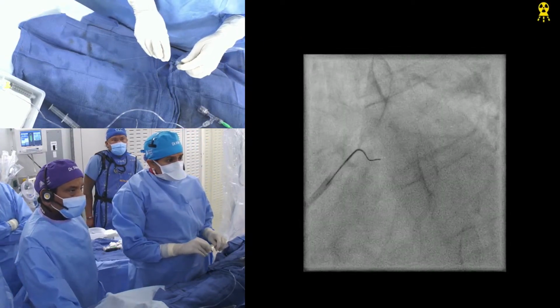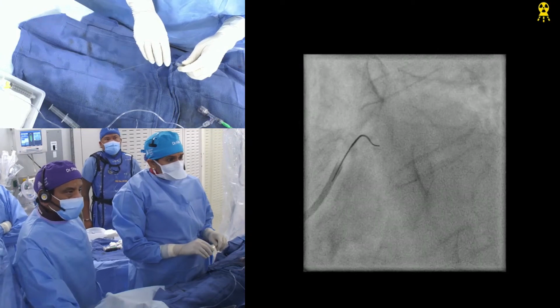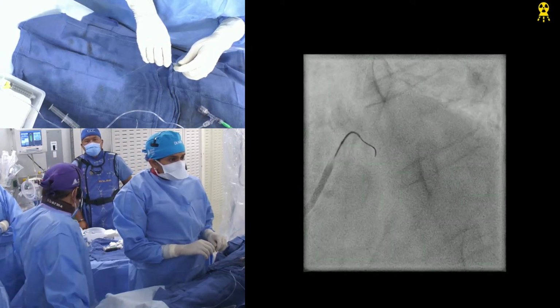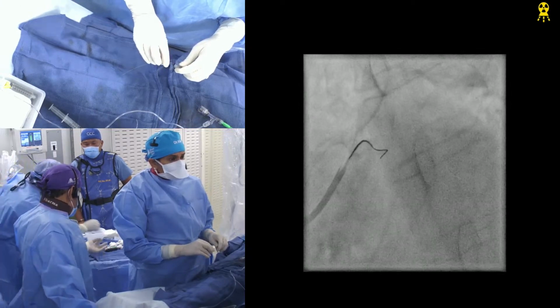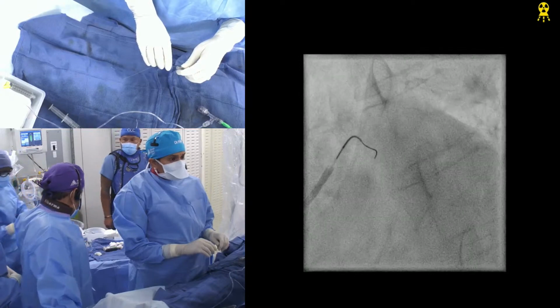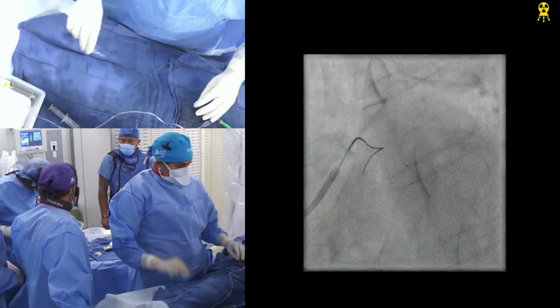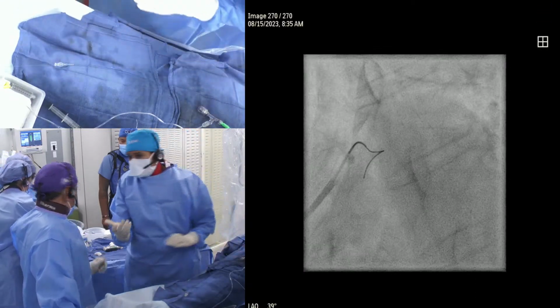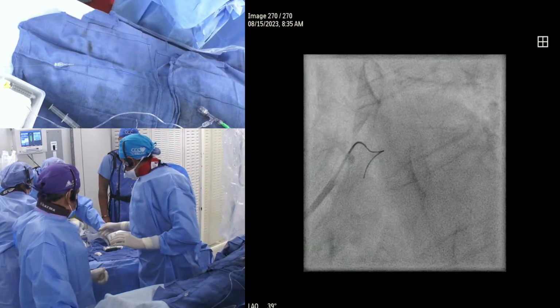You did not try the whisper though. Not with this 120. We did a whisper earlier. Earlier we had that whisper wire, yeah. So this is the only way. Throw this away. The atrial branch, yeah. Both of these are atrial branches. Whisper? No, throw this away. Samin, what is this? Pull up the whisper. Yeah, next wire. That's this Miracle.